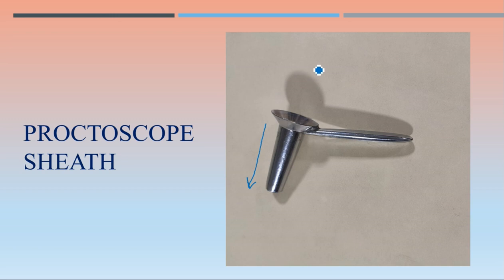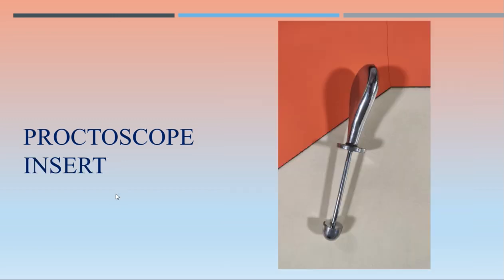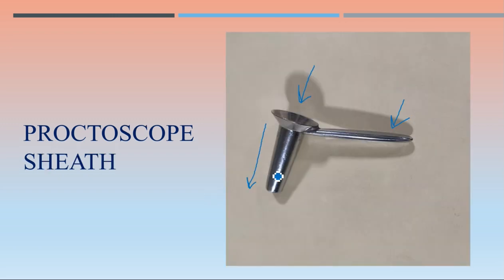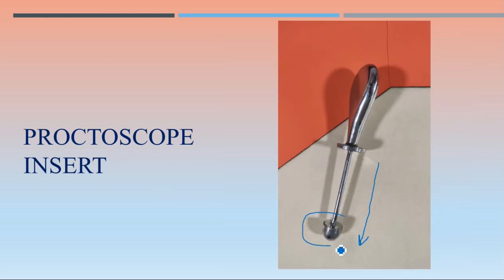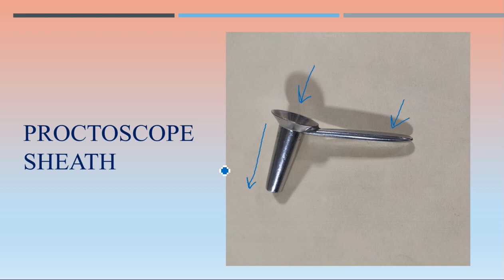Through this portion we shine a light and visualize structures. This is the handle used to hold the instrument. During insertion, to avoid anal trauma, we use the proctoscope insert — it goes inside the sheath and is atraumatic, avoiding damage to the anal mucosa. This is the handle of the proctoscope insert, and these two instruments are routinely used together.